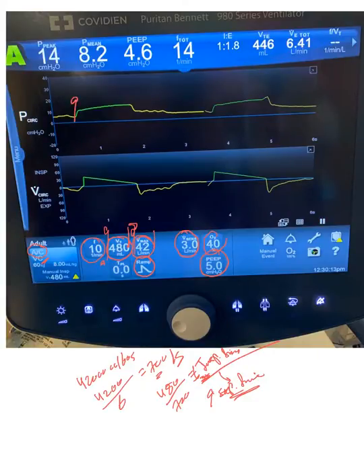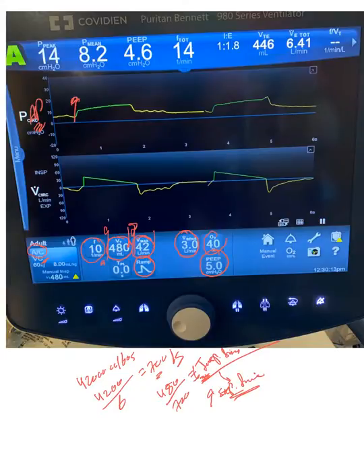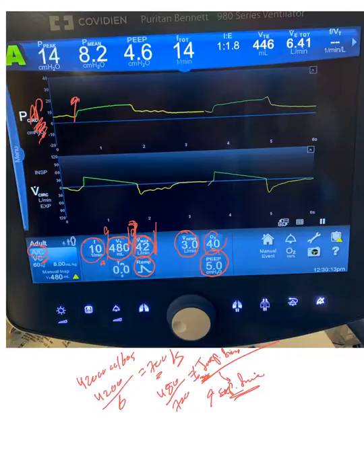A higher flow rate will require a higher proximal airway pressure. So you should know: the higher the flow rate, the higher the proximal pressure required. Conversely, a lower flow rate will require a lower pressure.